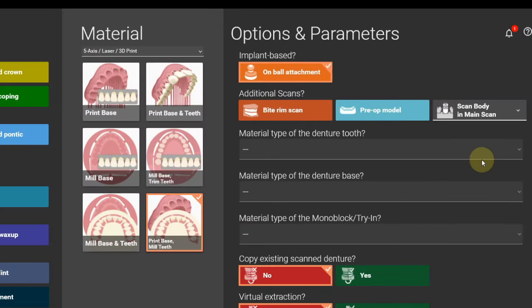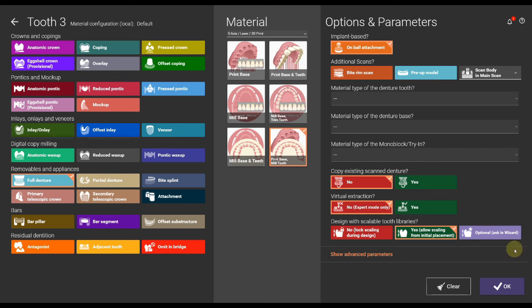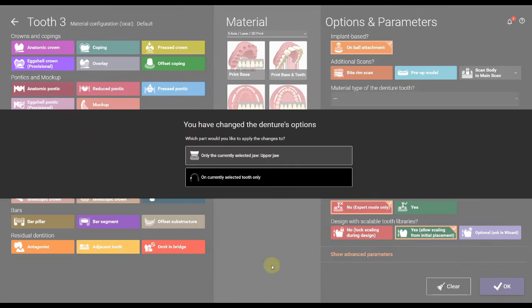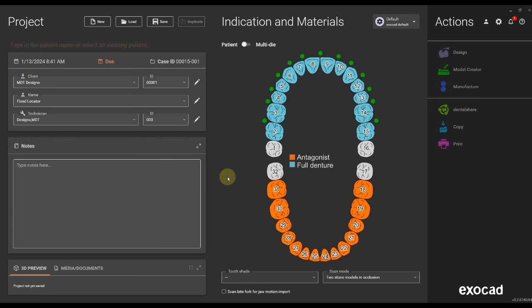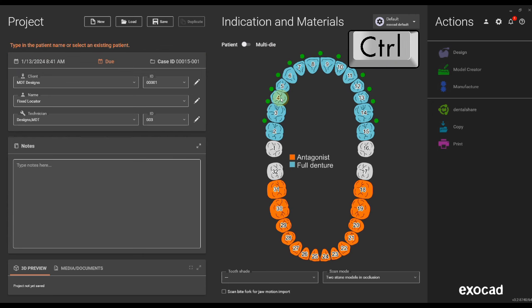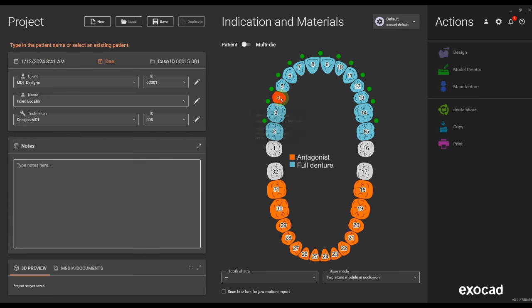Select the scan body mode, meaning either you have a separate scanflex scan or you have scanflex in the preparation scan. Make sure you only change that for one tooth.